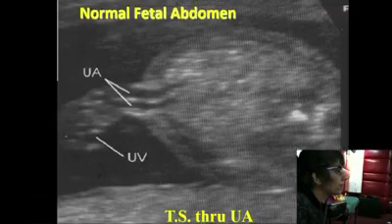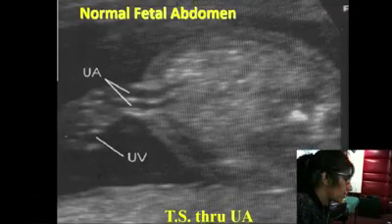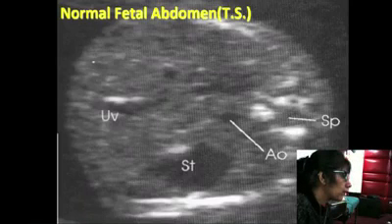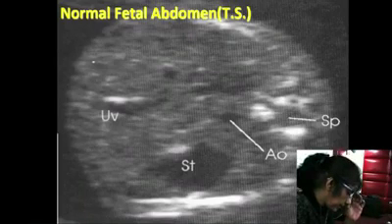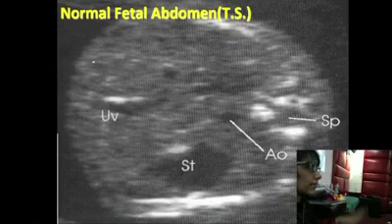the GI obstructions. Now when you talk about GI obstruction, first of all, before you go to anything else, let us see how we will approach a patient. Whenever you are doing the scan, now when you're seeing the transverse section of abdomen, that is the primary section where we judge for anomalies. What are the normal cystic areas you come across?